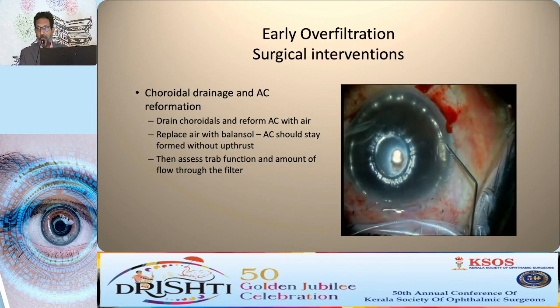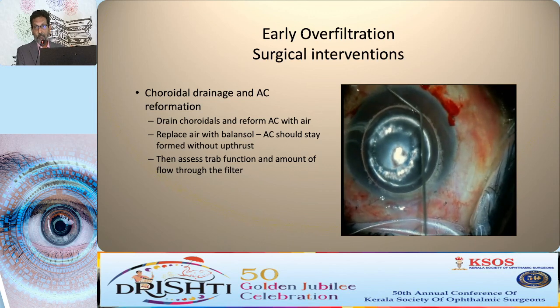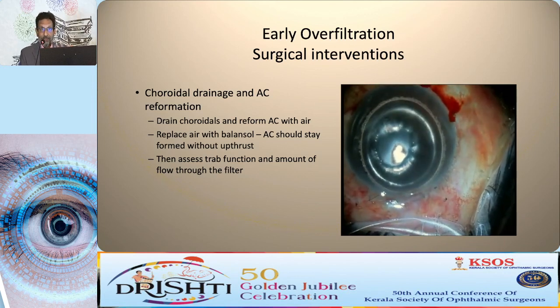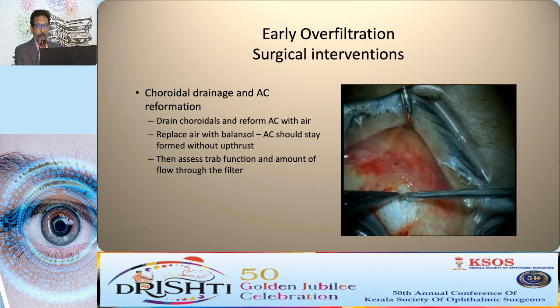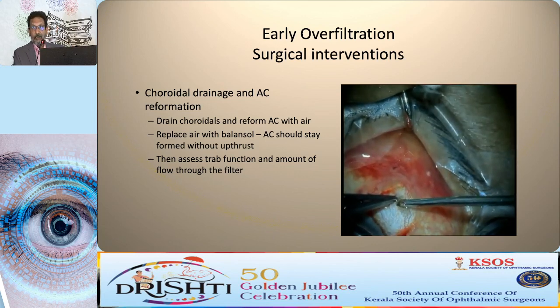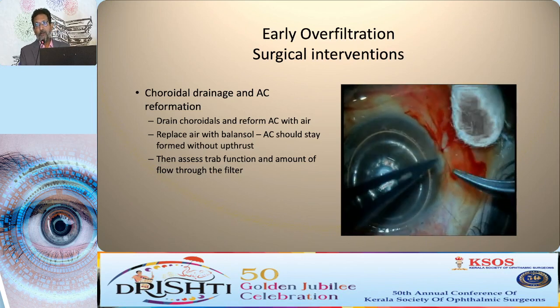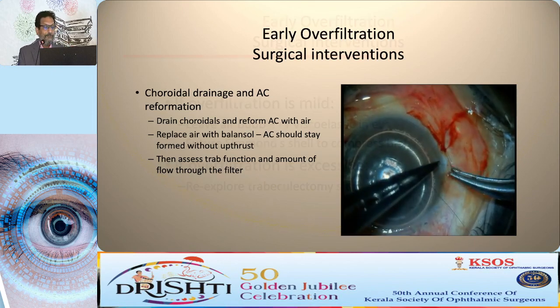And once you've adequately drained some fluid, you reform the chamber with balansol. You've already put in air, but the chamber has to stay reformed without any up thrust from behind. Stay formed with balansol, and that's your endpoint. I usually use cautery to cauterize the scleral edges so that it delays the healing of that drainage site. And I want it to keep draining for the next 2 or 3 days. That closes spontaneously. When I've had occasion rarely to go and re-explore the site, I find it difficult to find where that incision was made at all.